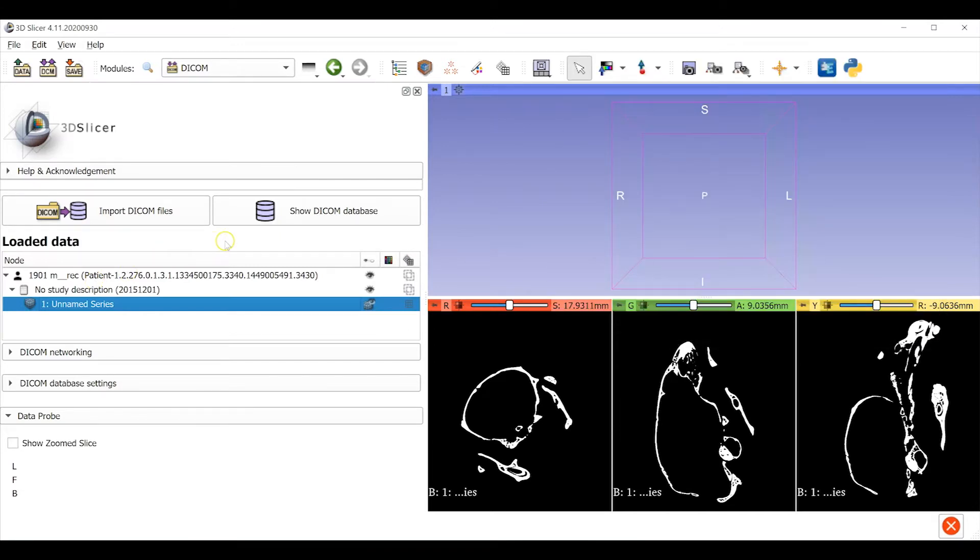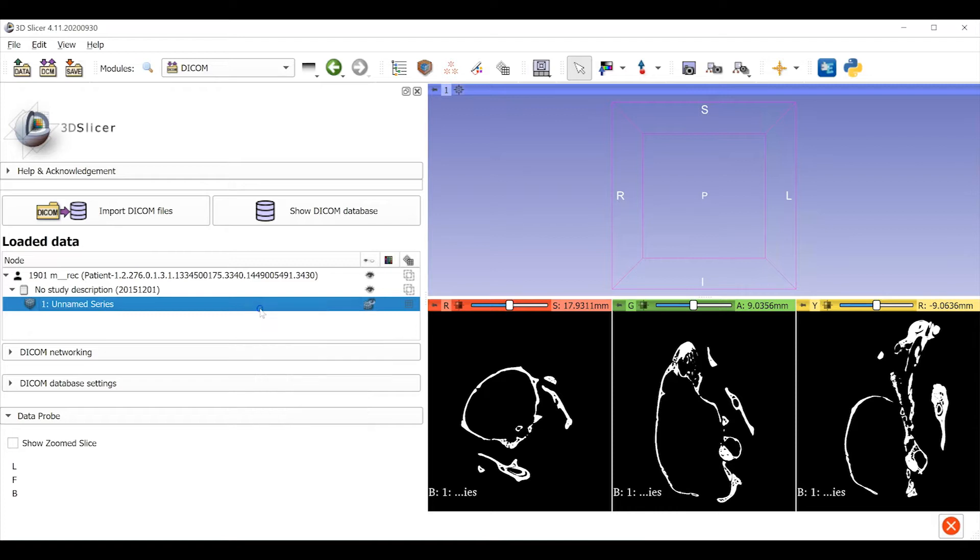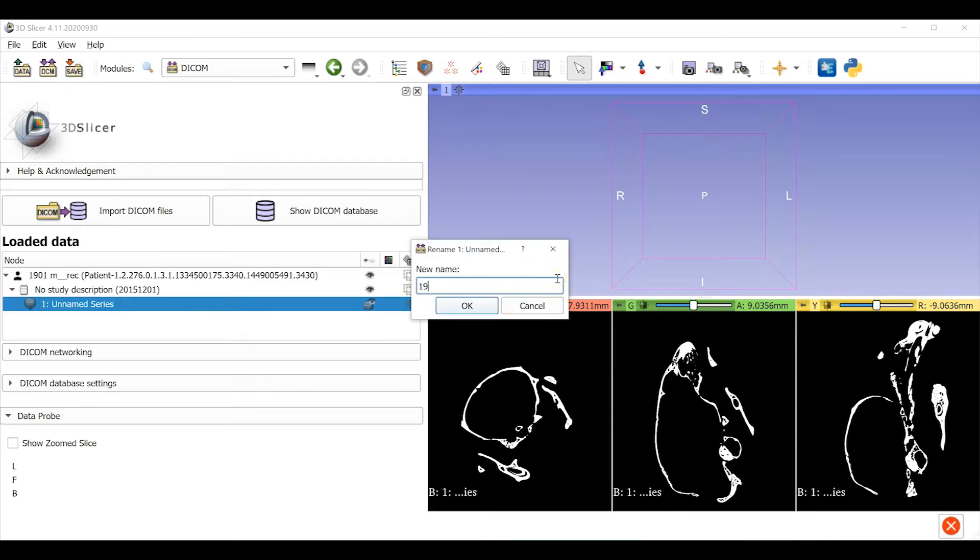We're starting with the default settings here. First, I like to rename the data object that I'm working with here in the data module. We only have one image volume for this mouse, so we can use the specimen number to name the data object. Right-click on the object and select Rename. This is, for me, specimen number 1901M.